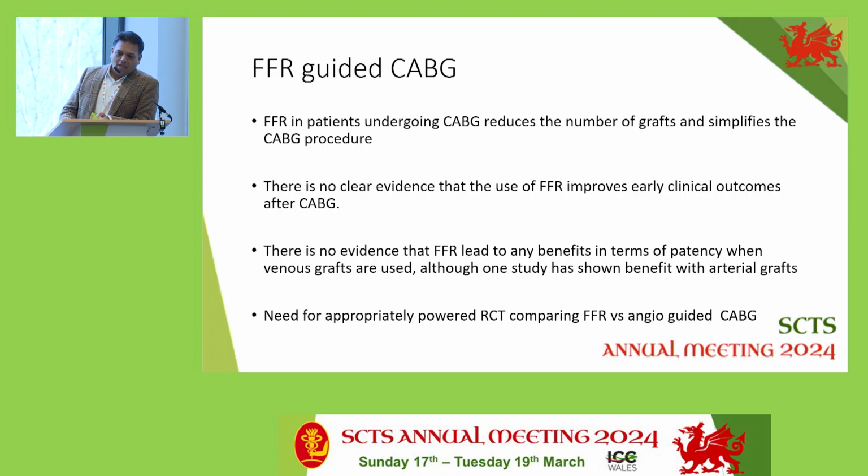So to summarize these slides, FFR in patients undergoing CABG reduces the number of grafts because it simplifies the CABG procedure. In a general sense, you're less likely to put grafts on individual arteries because most of the circumflex and RCA lesions tend to be pressure wire negative.